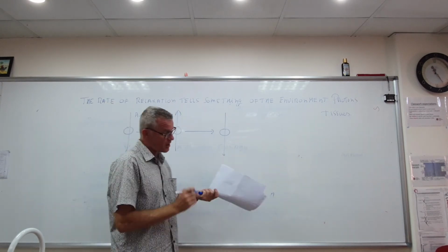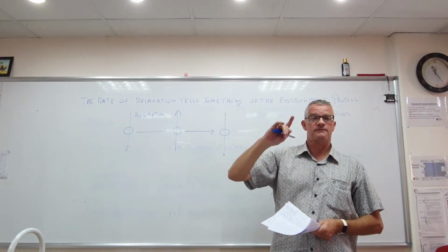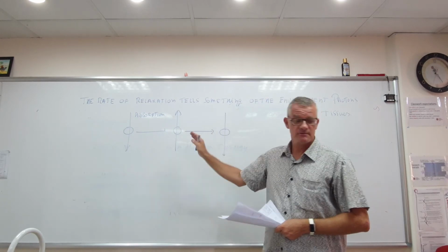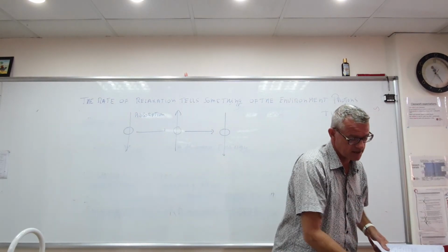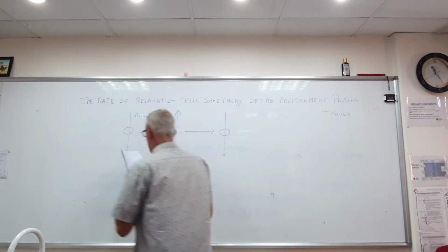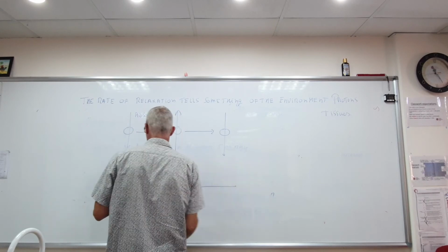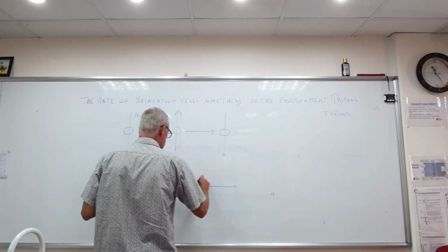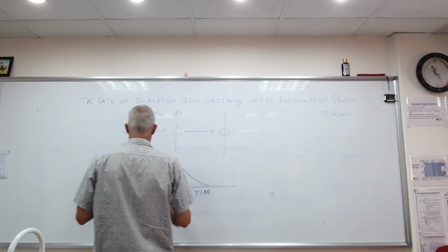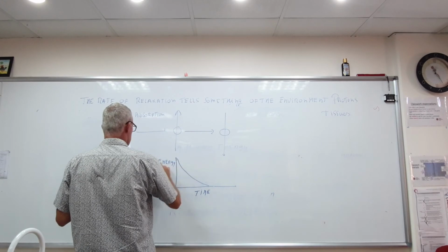Now remember, there's always still this strong magnetic field, okay? They are still in the strong magnetic field, but we're going to give them the radio pulses, okay? Right. So what is going to happen here is energy is released over a certain amount of time.